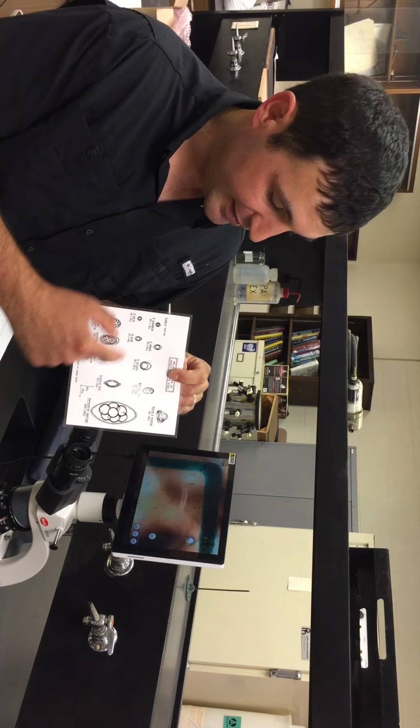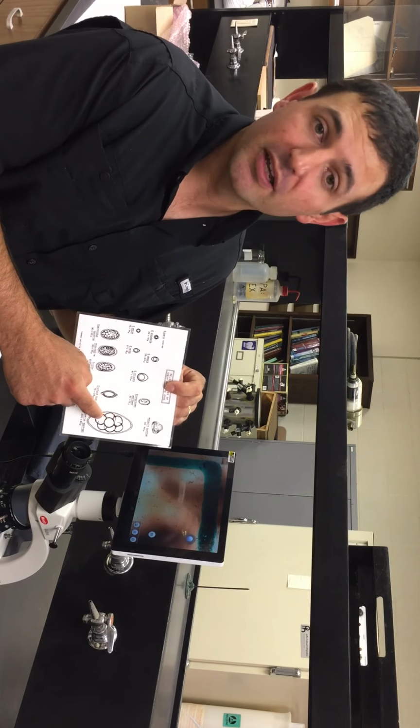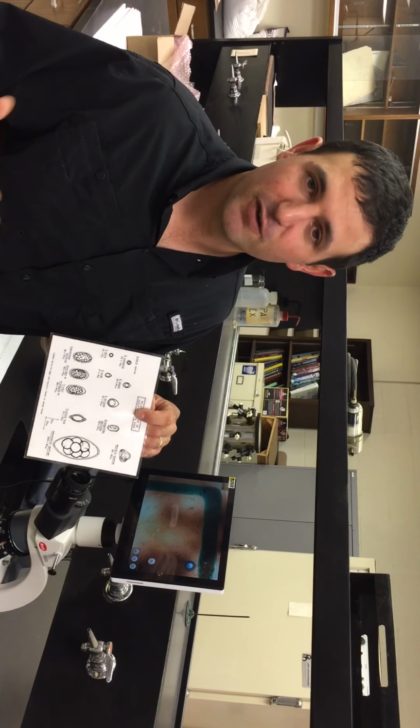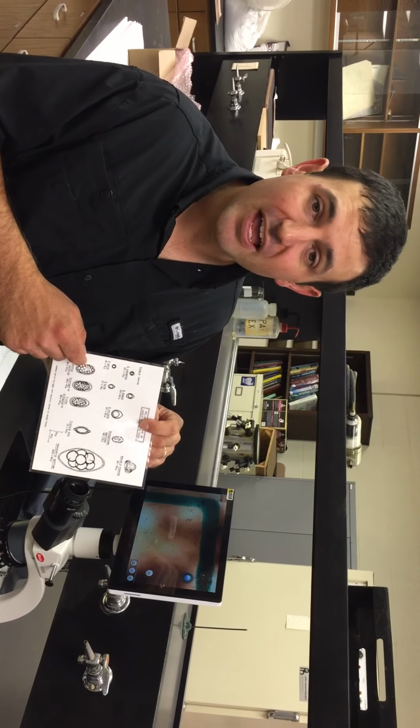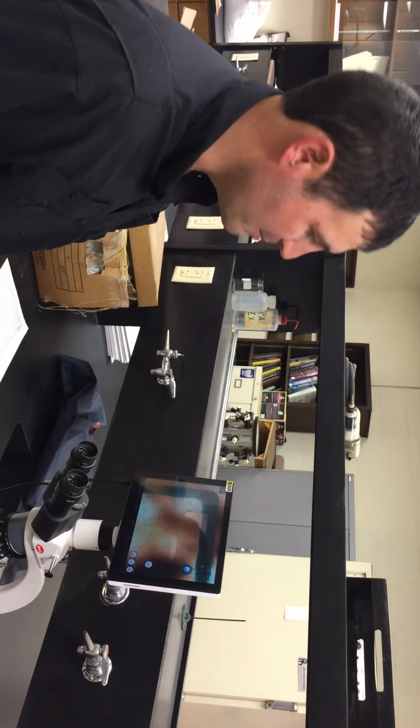Okay? So I've got a little chart here that's got some various parasite eggs on it. They range completely in size. Some of our coccidia are very tiny, and then we've actually got a really big one, a Nematodirus. But we're looking for Haemonchus contortus, which is kind of football shaped. It's got some little cells inside there, and it'll be easily recognizable when we get it up on the slide.